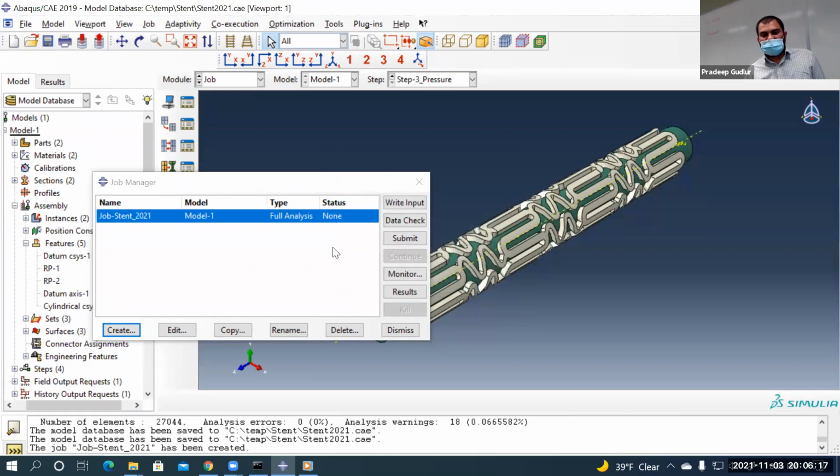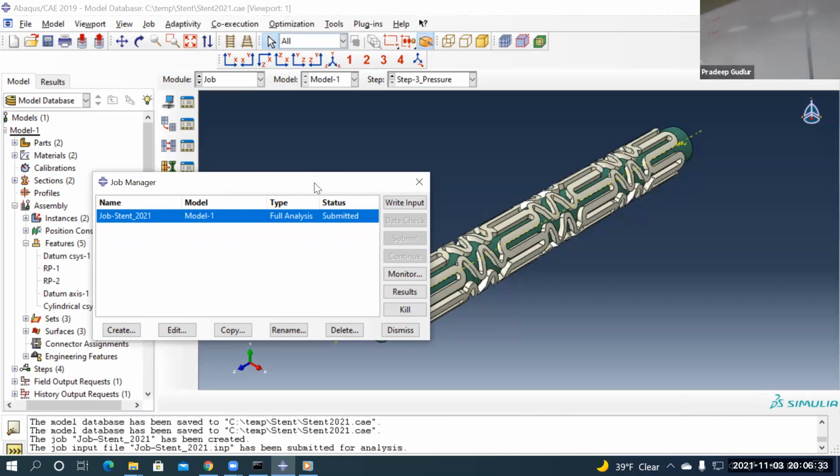File, set work directory, or create a folder and save it there and then run it. If you submit it, it will take at least 5 minutes, I think. Initially it will go through some convergence problems. That's to be expected, nonlinear geometry. If we missed anything in the coordinate system, if you use global and radial, it would give us errors, saying you have mixed coordinate systems.